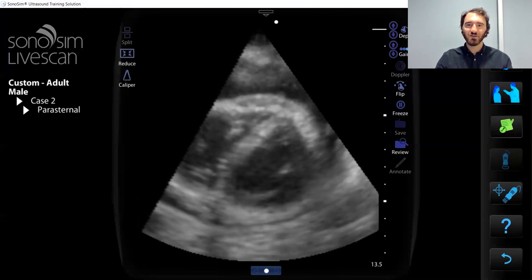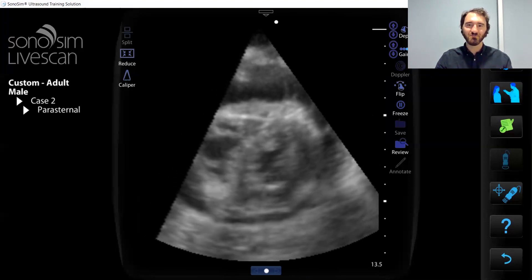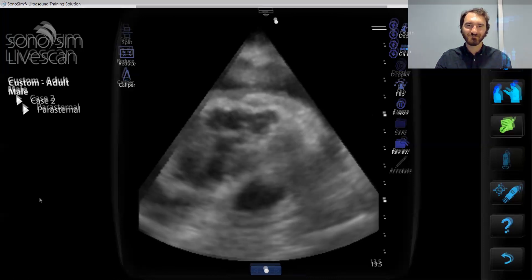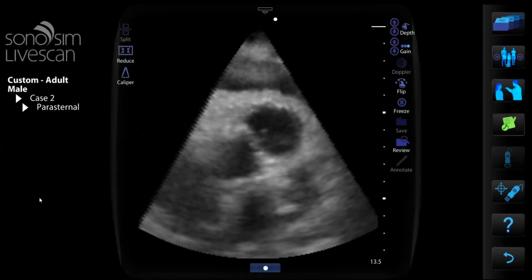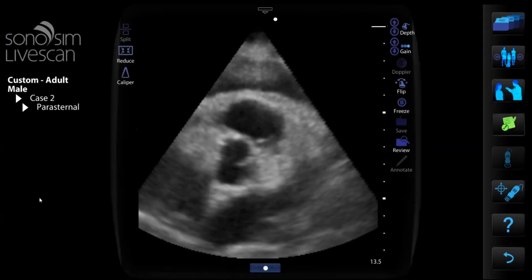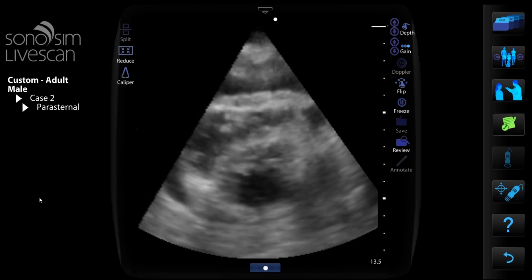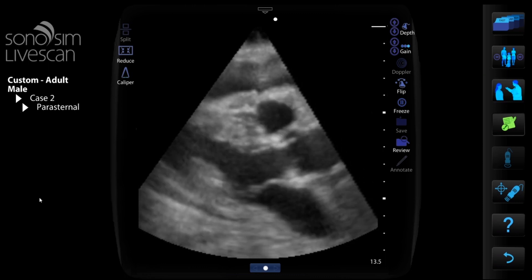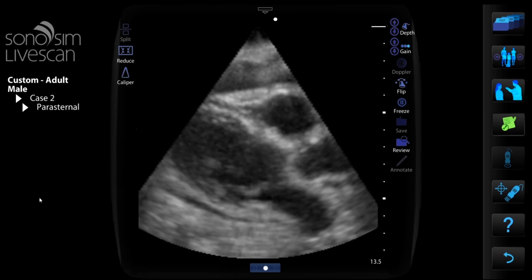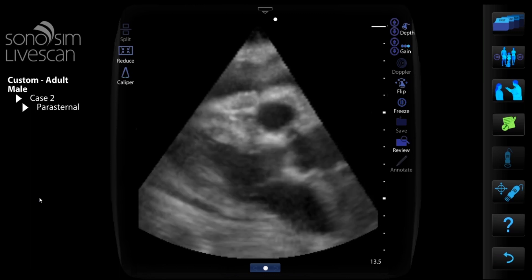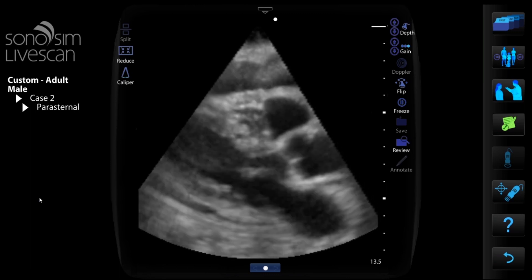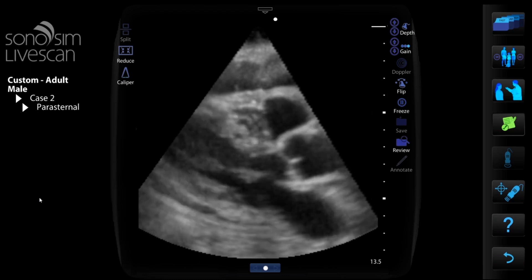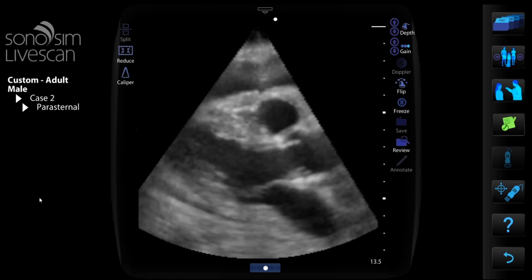I'm going to show you how you can use SonoSim LiveScan with Case Builder to run remote simulations. SonoSim LiveScan allows you to teach your learners to integrate ultrasound findings into their medical decision making by letting them scan real patient ultrasound data sets with real pathology, such as this case that demonstrates echo findings consistent with cardiac tamponade physiology.